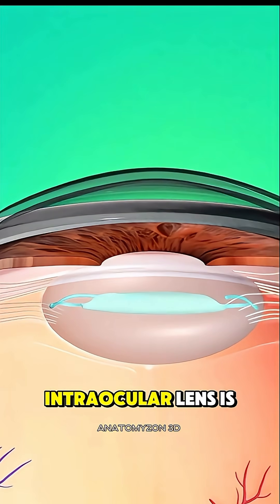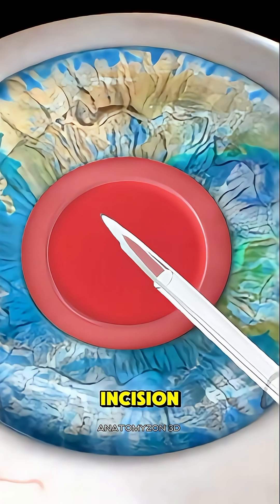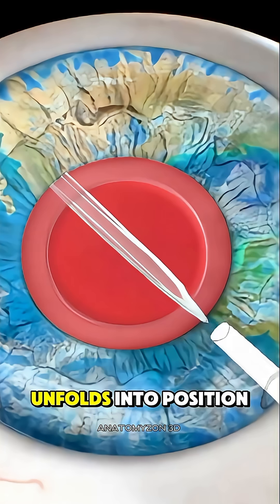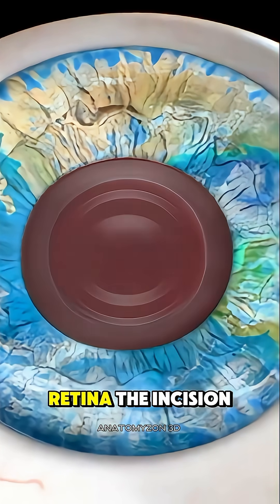Next, a clear artificial intraocular lens is folded and inserted through the same small incision. Once inside, it unfolds into position, restoring your ability to focus light clearly onto the retina.